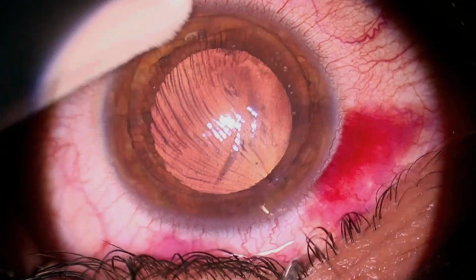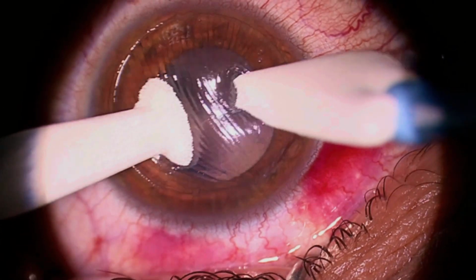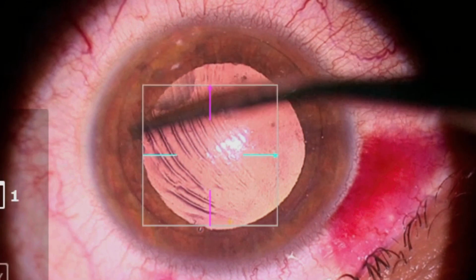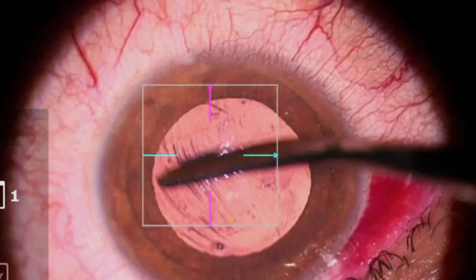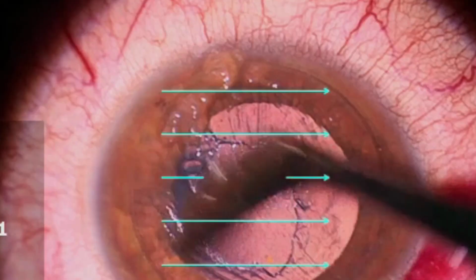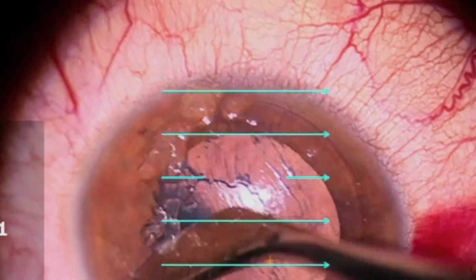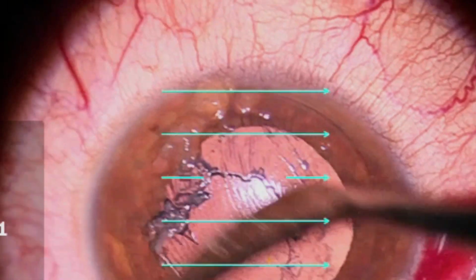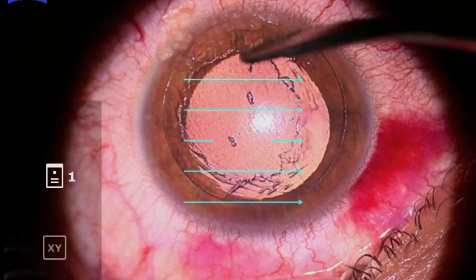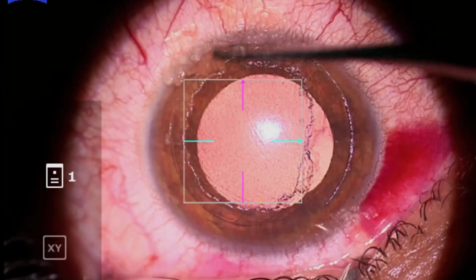We repositioned the flap and gently but firmly stretched the flap on the epithelial surface, pushing the edges away from the central cornea. This allows the flap to fill in the ablated stromal bed. We then debrided the epithelium overlying the striae. While some surgeons believe that in early post-operative period, epithelium removal is not necessary, in our experience we found that it helps to remove the epithelium because even in 24 hours the epithelium remodeling over the striae is sufficient to prevent the flap from getting repositioned completely.